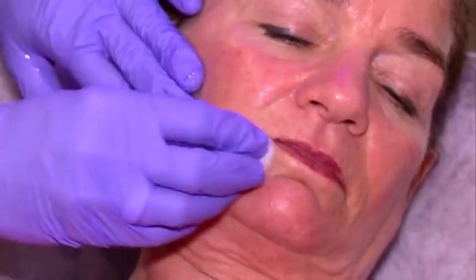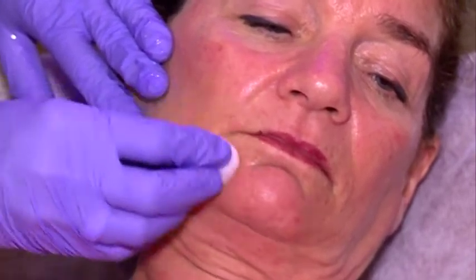All right. Okay? So what I can do now quickly, if you want, I can show you and demonstrate. Can I get some Belotero Intense with the 27G needle? I will show you quickly how I can do my marionette lines. So what do I think is a good technique? A technique is something you can start tomorrow with, which gives you constant results, which are very, very nice. If the technique is very fancy, it doesn't help you a lot. Okay?